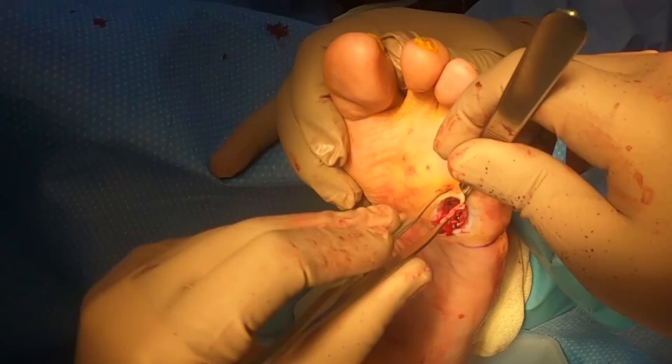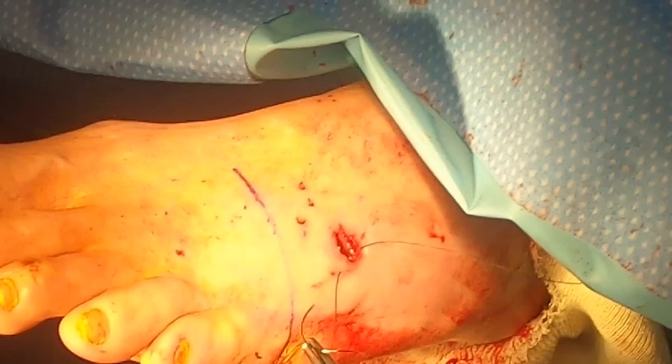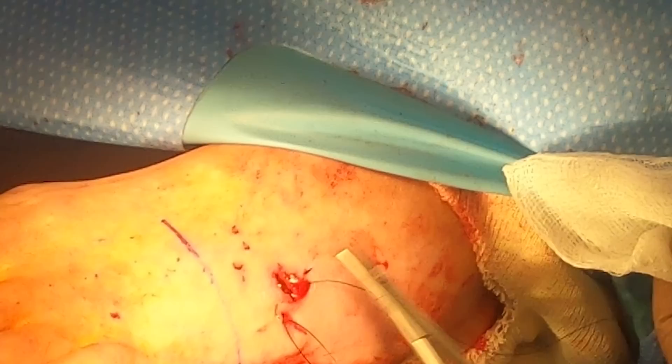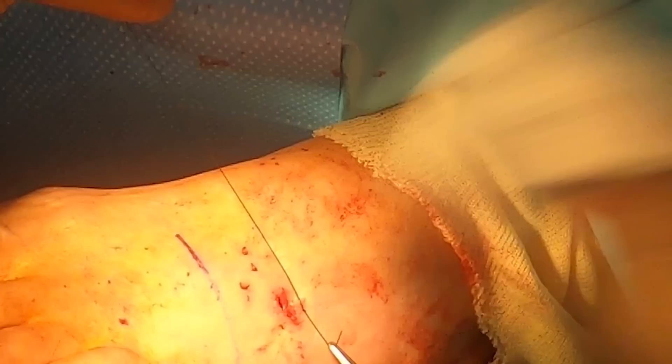We're going to try to bring this wound as close together as possible. I'm going to go ahead and close the top incision. You can already see his skin is just paper thin, so I'm going to use a non-absorbable nylon, which is pretty strong. This type of stitch is called a horizontal mattress suture technique. This will bring the edges up of that incision to make sure it heals, and it's also a little bit easier to take out after two or three weeks once that incision has healed.